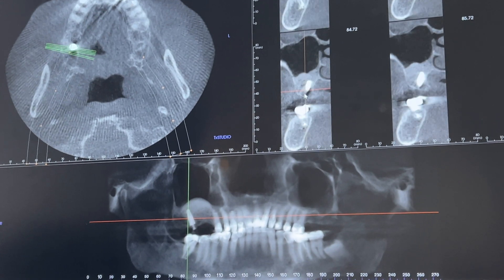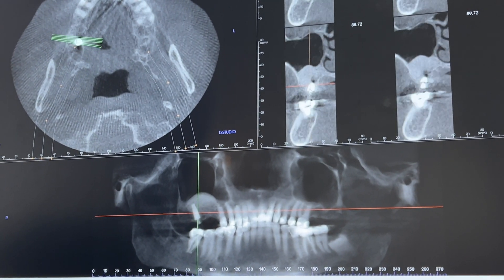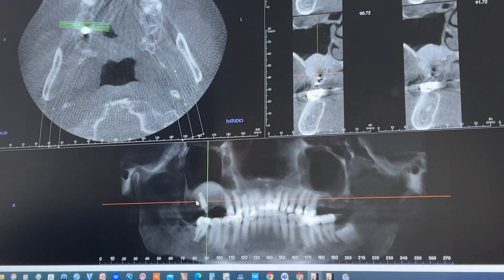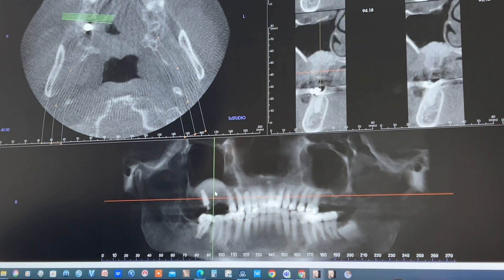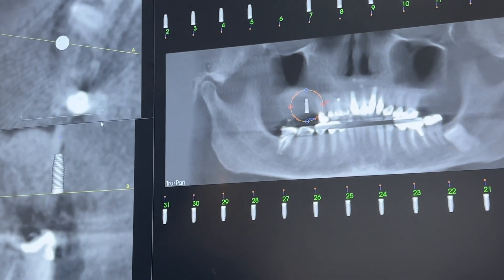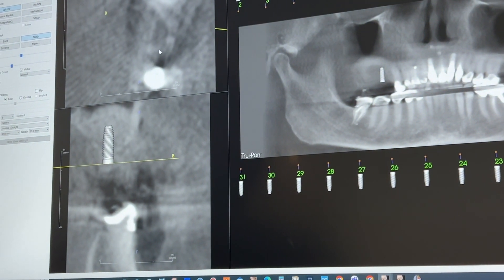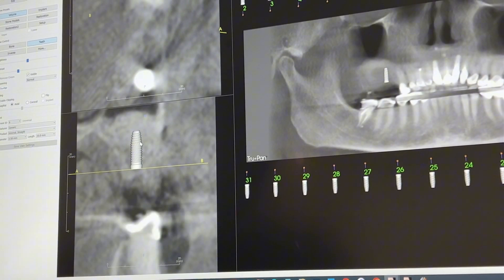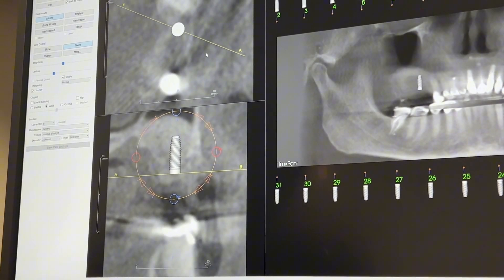We have one implant that was placed, and the reason why we angled this is to engage a little bit more bone because the bone goes like this, so it's more sturdy. For this area, for the future implant, we're going to wait six months for the bone to heal and we should have enough to place a 13, maybe 16 millimeter implant in length, 5 millimeter in diameter.